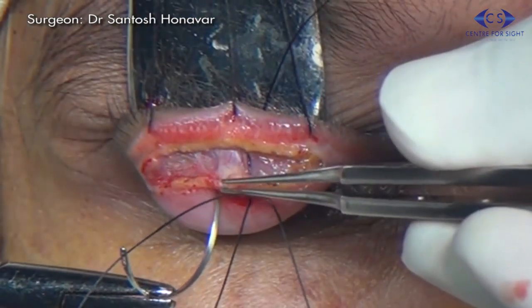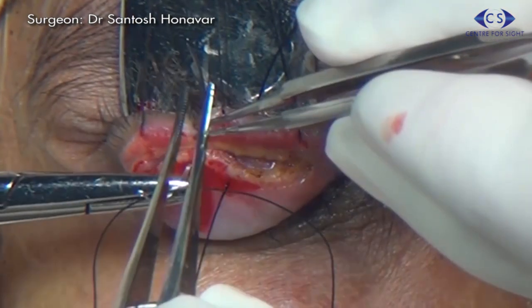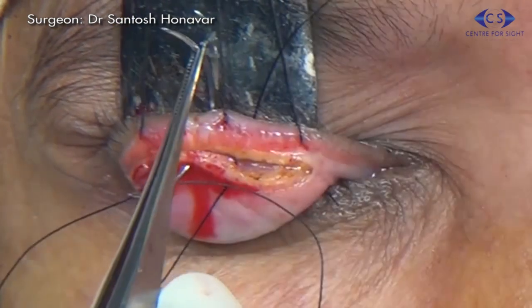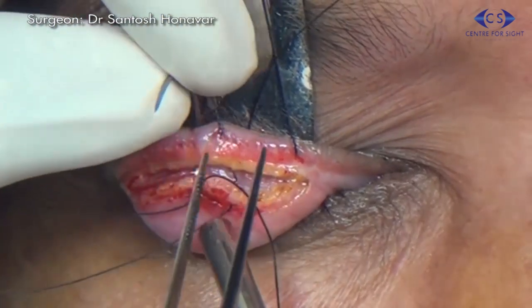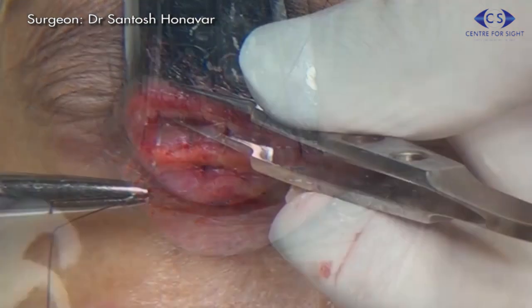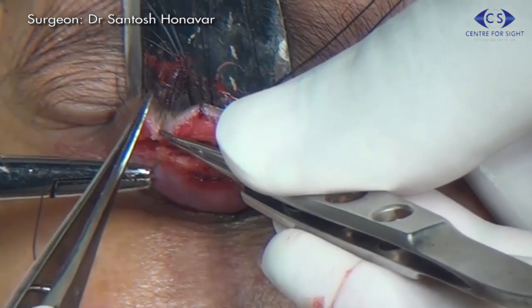A free needle is used to thread the other end of the suture in a similar fashion. Two other cardinal sutures are taken similarly on either side of the central suture.